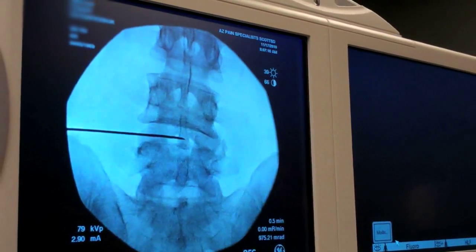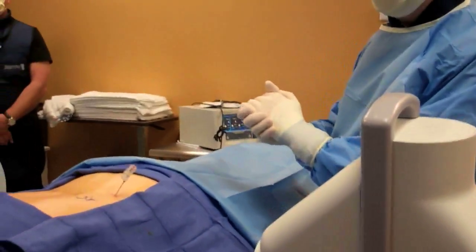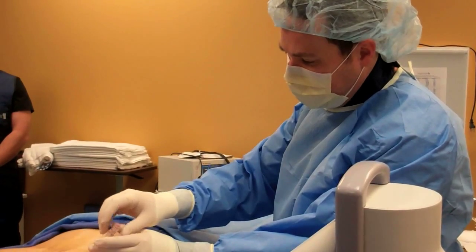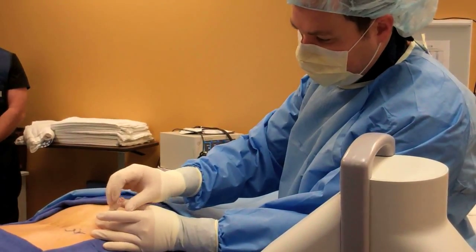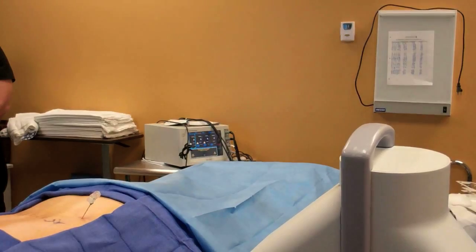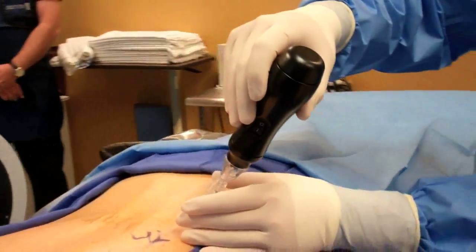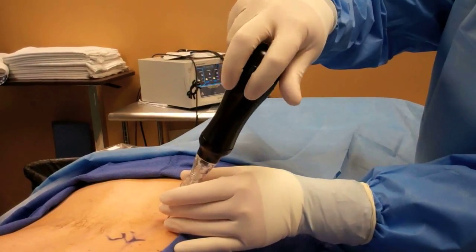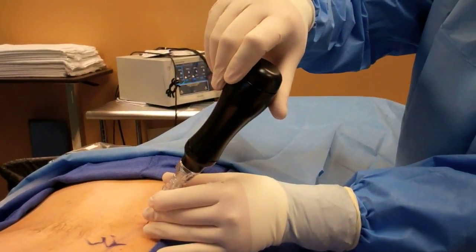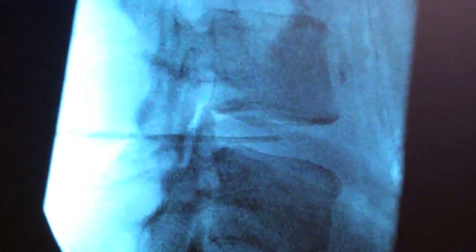Okay, that's the perfect position. We're going to go ahead and get started here. Are you feeling a little bit sedated? Yes, let's get in. Okay, perfect — if you need any more, you let us know. So now we're just going to take out the needle here and just leave the trocar in place. And then we're going to place our instrument into it — screw it all the way in there. Basically, what we want to do is stay in the central part of that disc, and we're going to go live under X-ray guidance.